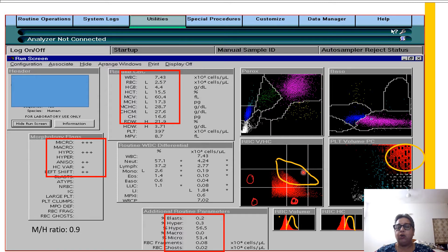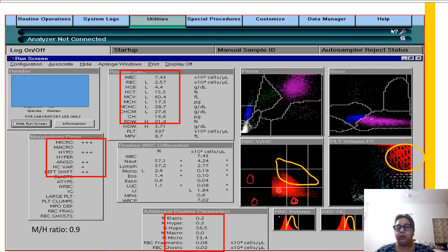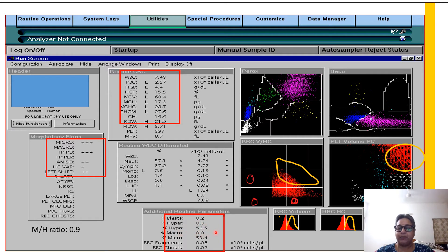Now the normocytic normochromic red cell scatter has shifted to the left and downwards. We know that hypochromasia is on this side and microcytosis is below. So you have a good population of microcytic cells that are also hypochromic. The scatter tells you we are dealing with a microcytic hypochromic anemia, which is corroborated by the histogram. The numerical RBC differential shows percentage hypo is about 56% and percentage microcytic red cells is 53%, which fits with what we see on the picture.